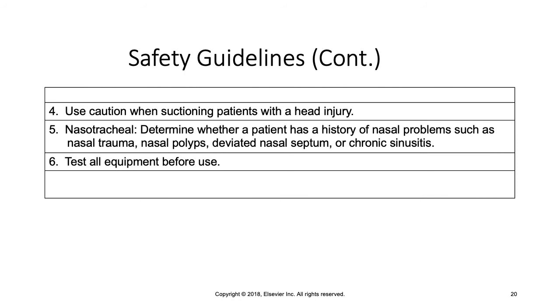Always, all equipment has to be tested before use. So you're going to test your suction before you apply it to the patient. And that's pretty much it here.